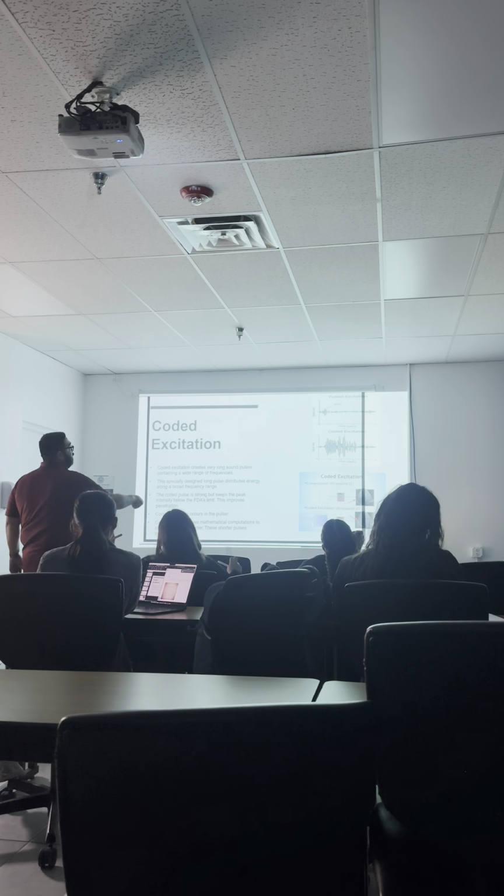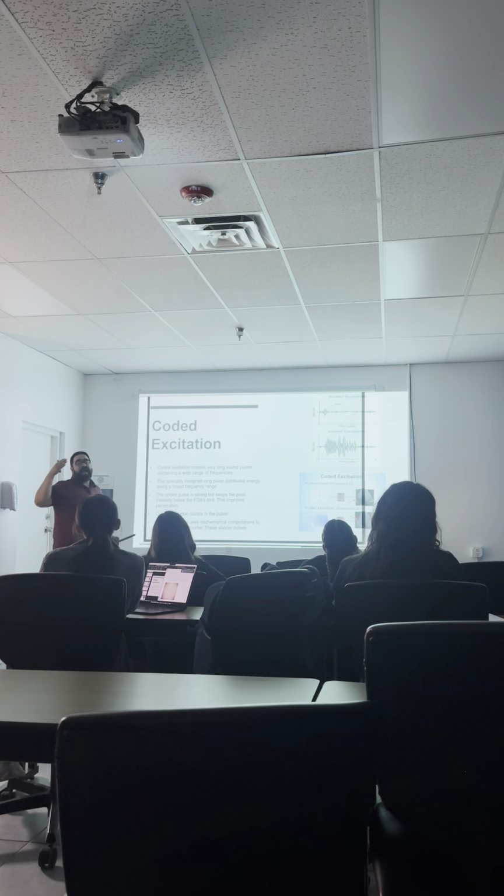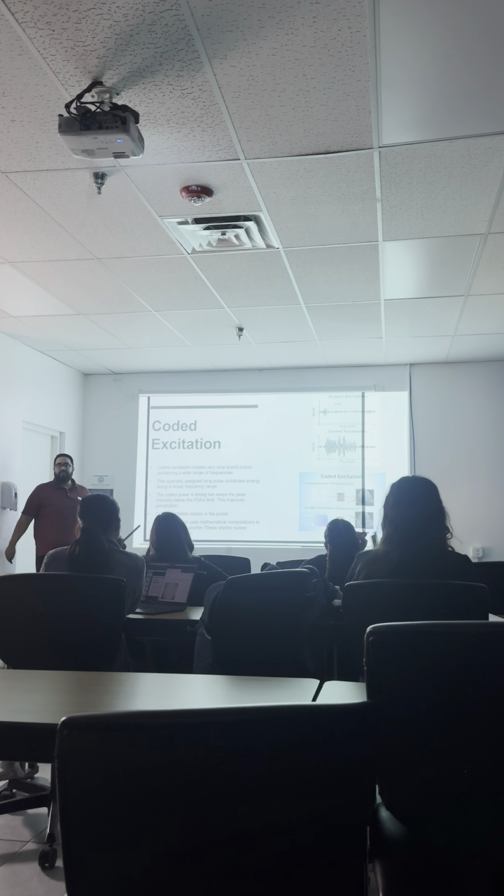Because it's sending this very long pulse, right? It has more penetration because it's active for a longer time, it travels more, but upon reception, it'll pick out only the frequencies that it needs to make the image of the diaphragm. Okay? What is it called? Coded excitation. And what does coded excitation do? More penetration. How?